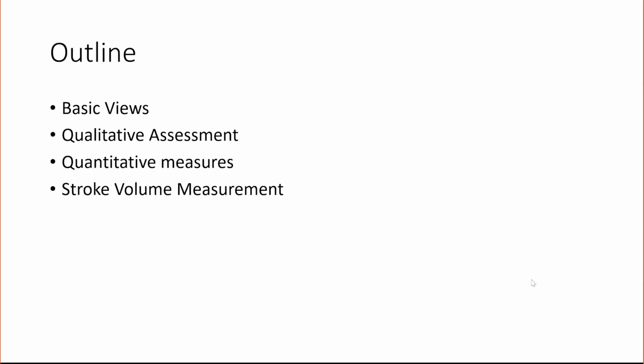So this is the outline of the talk. We'll talk about the basic views. We'll do some slides on qualitative assessment, and then quantitative measures, and lastly, a little bit about stroke volume measurements.